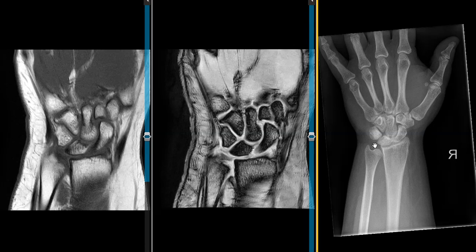Normally the gap here is a little bit smaller. When the ulna is too long, it will impact into the lunate bone and cause trouble. When it's too short, there'll be abnormal stress on the lunate bone because the radius articulates with the lunate bone, and the load here is abnormally high because the ulna is not distributing some of that stress. It's all on the lunate bone, so we would say there's a mildly negative ulnar variance.